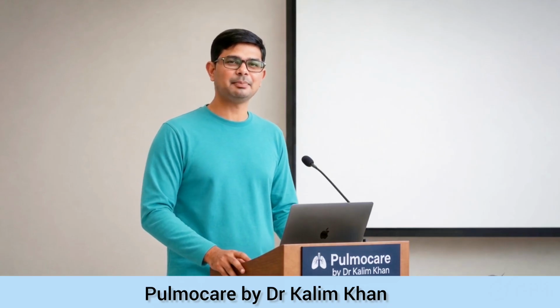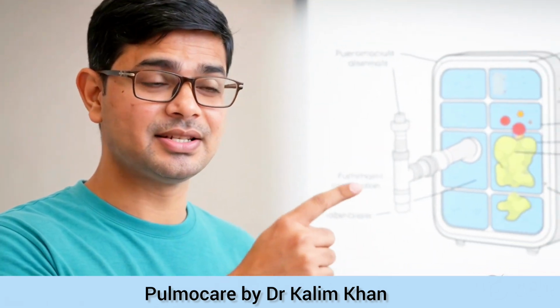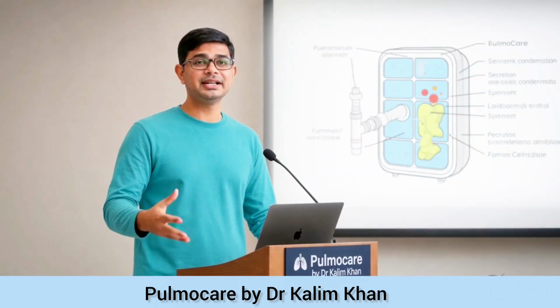Another important component is the filter. Filters can reduce contamination of the ventilator and circuit and may provide protection against microorganisms and particulate matter depending on the type and location of the filter. However, a filter can become wet or obstructed because of secretions or condensation. A blocked filter increases resistance and may contribute to increased airway pressures. Therefore, filters should be checked regularly and replaced according to the manufacturer's instructions and ICU protocol.